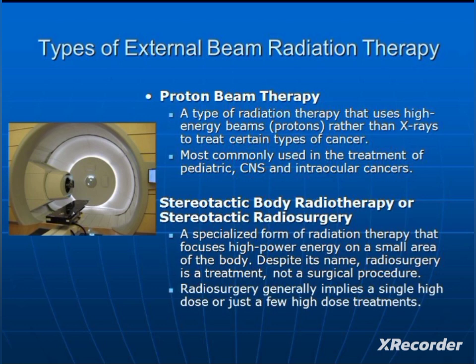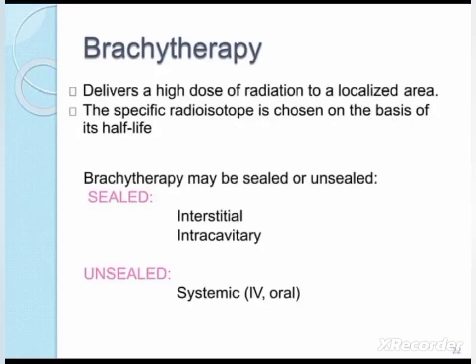Next one, stereotactic body radiotherapy or stereotactic radiosurgery. A specialized form of radiation therapy that focuses high power energy on a small area of the body. Despite its name, radiosurgery is a treatment, not a surgical procedure. Radiosurgery generally implies a single high dose or just a few high dose treatments, that is known as stereotactic body radiotherapy. Here we are using high energy radiation.